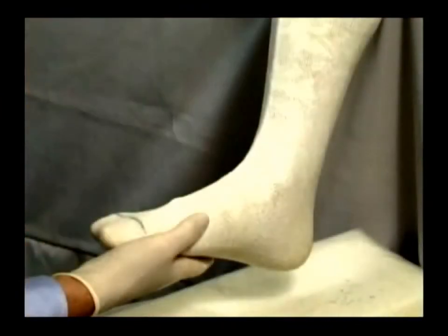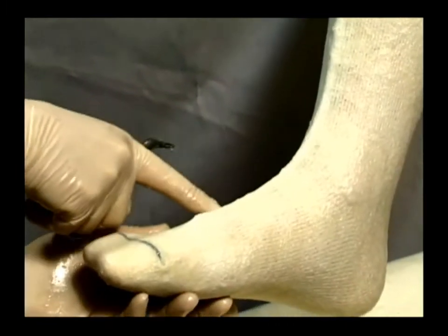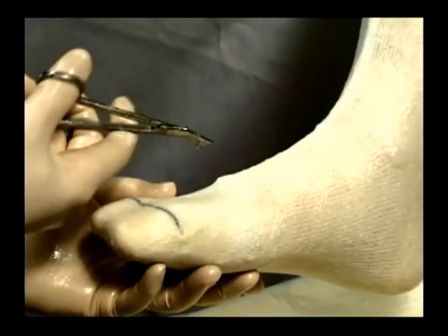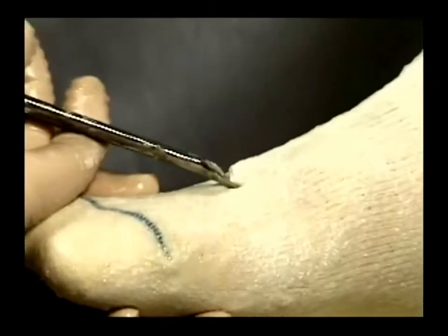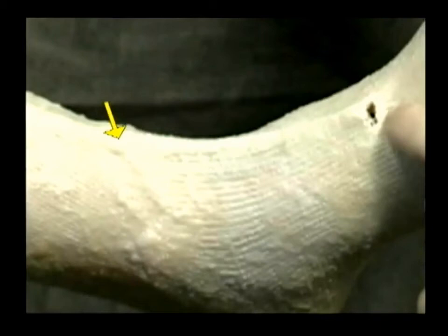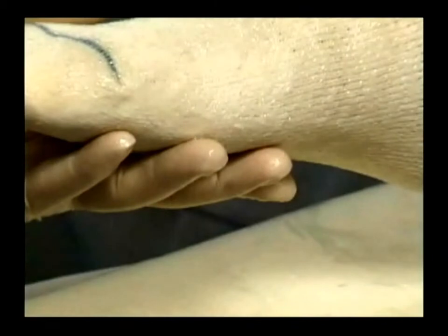When the sock is fully in place and all the wrinkles are stretched out, address your attention to the distal or toe end of the tube. Use palpation to identify this point. Then, using a pair of STS scissors or similar device, make a tiny cut in the material to create a starter hole used in the removal process. Shortly after applying the sock, the resin will begin to foam. During the foaming process, the resin must be worked into the underlying fabric to achieve a strong, smooth mold. This is done by massaging and rubbing the resin into the fabric until the foaming stops.